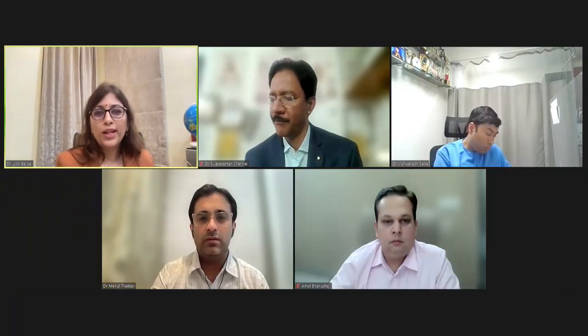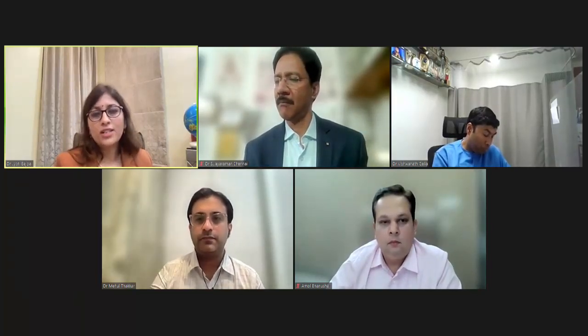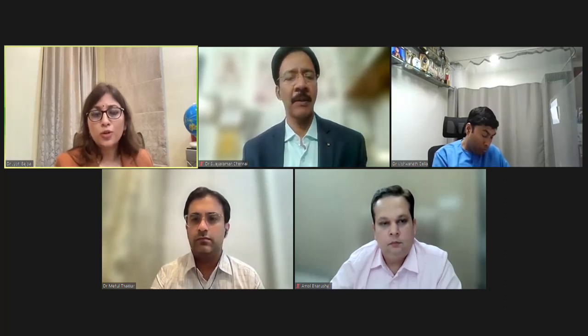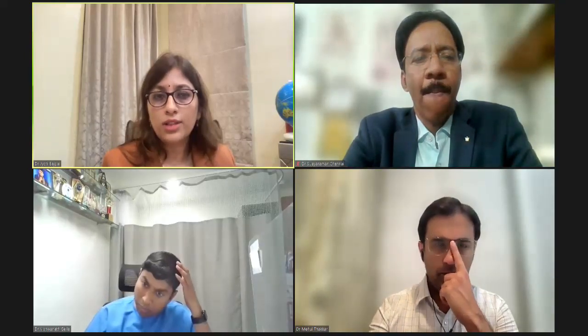So, as we know, there are a lot of methods of biopsies like rigid forceps biopsies and flexi forceps biopsies. Undiagnosed pleural effusion is diagnosed by medical thoracoscopy, but still 20% of cases are undiagnosed. So we are chasing these 10 to 20% cases: how to enhance our yield in diagnosing these undiagnosed pleural effusions. For the last 3 years, I have been using cryobiopsy in our department, and our experience is good. But not all cases go for cryobiopsy. Those are the cases which have thickened pleura, where there is difficulty in taking biopsy with the flexi forceps. In these cases we are getting good results.